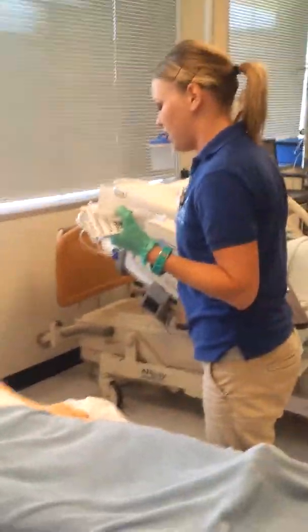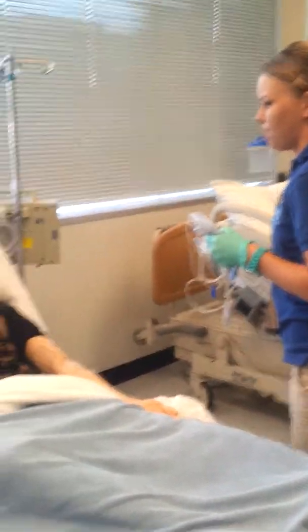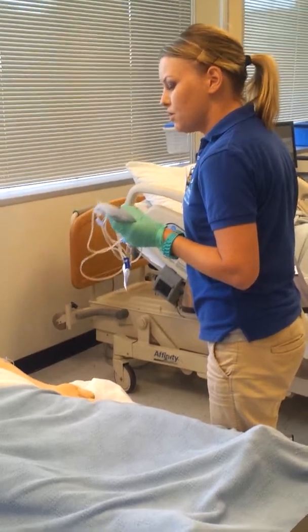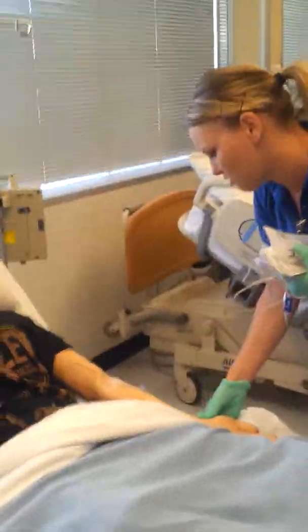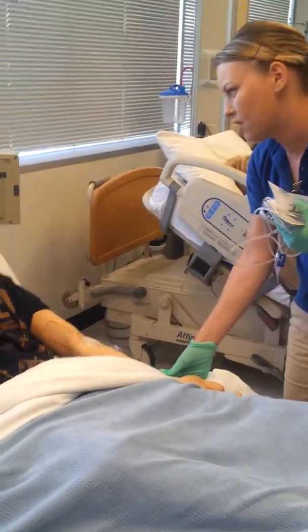Hi, Mr. Jones. My name is Josephine and I'm going to be your nurse for this evening. Your doctor has ordered some vancomycin to be given to you through your IV — it's to help with the infection that you have in your abdomen. I see here you've had it earlier today and you didn't have any adverse reactions — is that correct? Okay. I'm going to check your name band here. I'm going to need your name and your date of birth. Okay, great. And you don't have any allergies — is that correct? Very good.